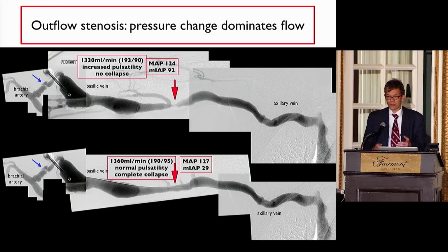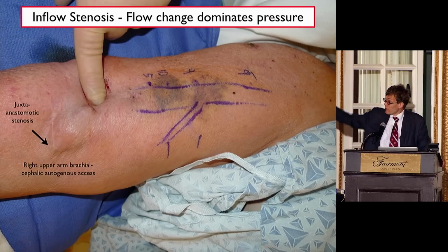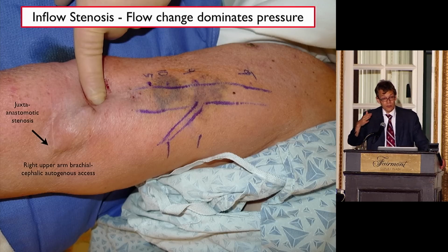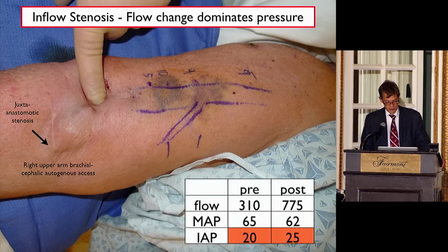So this access is super soft, the skin is completely intact. Yeah, you can put needles in there for years and years to come. Similarly, if you have an upper arm access like here with an inflow stenosis, even after years of use, no aneurysms. Yeah? And the sign of failure that it presents with is usually hematomas when the inflow stenosis becomes so tight that the flow drops, and with the tourniquet there's not enough augmentation anymore to safely place the needles.